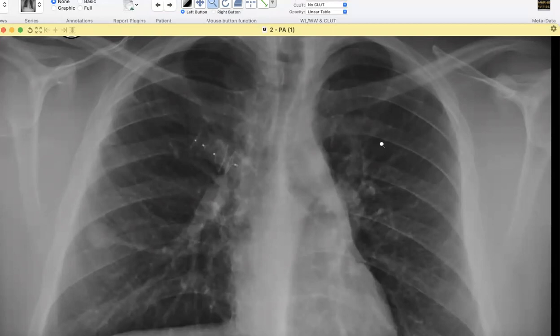And to take it further, the patient needs cross-sectional imaging to delineate these abnormalities and to look for further lesions. What do you think the probability of this patient having HHT is? What are the chances that this patient might have HHT?